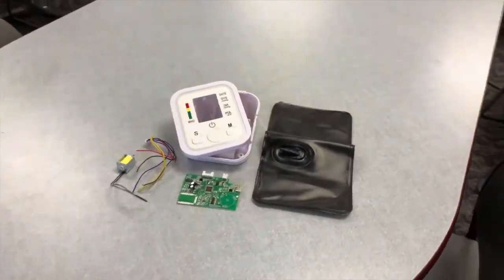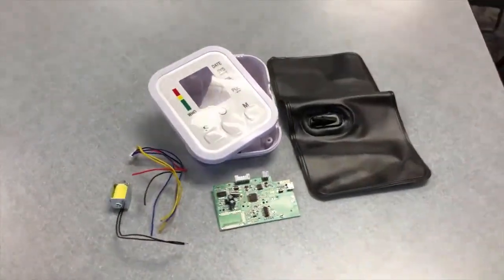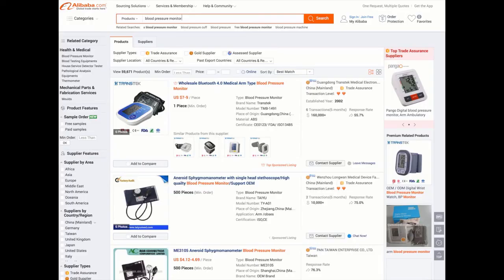This surprisingly complex device has several classes of components: injection molding, electronics, pumps, rubber tubing, springs, and plastic sheeting. Several components can be acquired from online sources like Alibaba in mass quantities and do not need to be made new, including the pump, plastic tubing, circuit board, and LCD display.